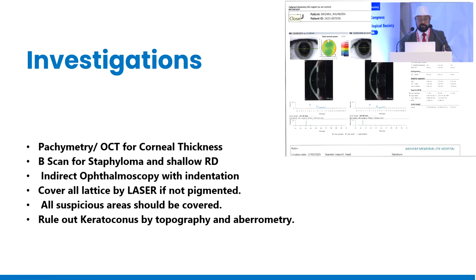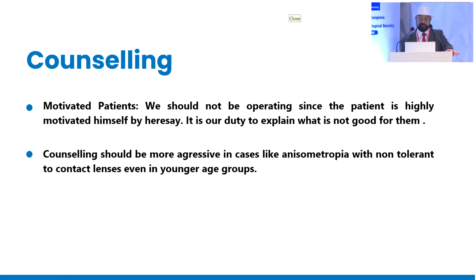Investigations, you have to do the pachymetry also, B scan for staphyloma and shallow RD. Indirect ophthalmoscopy with indentation is essential. Cover all the lattice by laser if they are not pigmented, and all suspicious areas should also be covered. Rule out the keratoconus by topography and aberrometry.